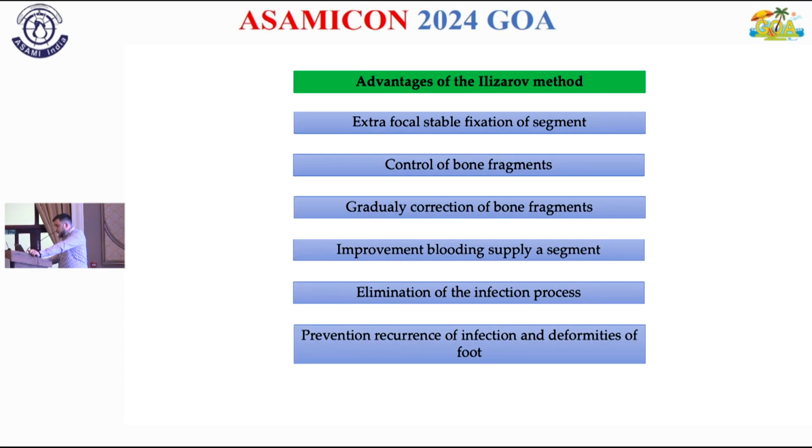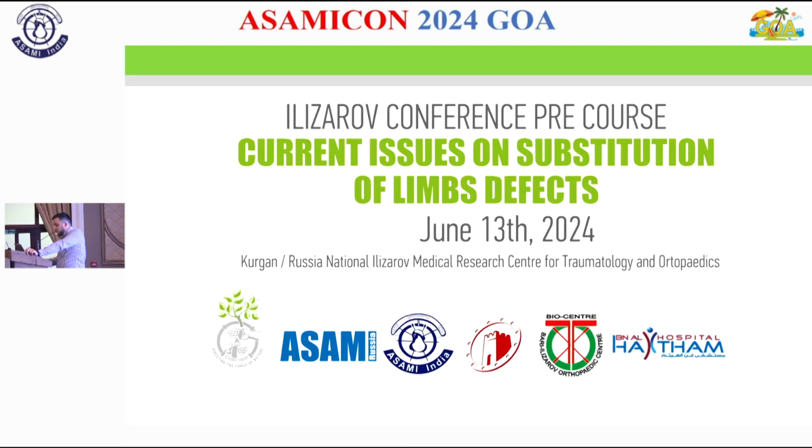So finally, which advantages of the Elizarov method can it give to us? Extrafocal stable fixation of the segment, control of bone fragments, gradual correction of bone fragments, improvement of blood supply to the segment, elimination of the infection process, and prevention of recurrence of infection and deformities of the foot and ankle.